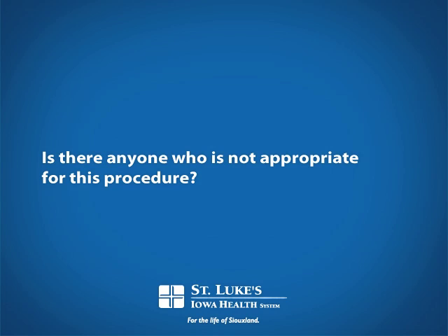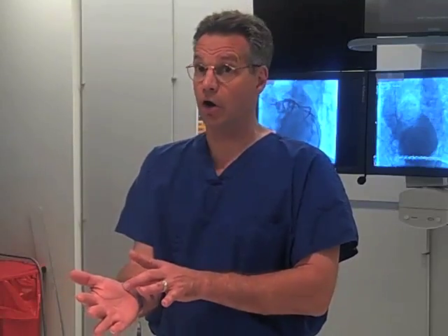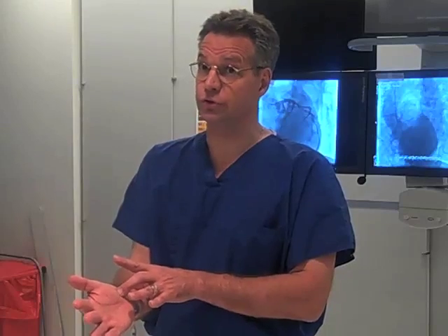Is there anyone that this procedure is maybe not appropriate for? Yeah, just about every patient, it is possible to utilize this technique. If there are patients who have previous problems with the artery in the wrist, if they've had trauma, or if the artery has been used for other surgical procedures, then obviously they're not going to be a candidate to utilize this.